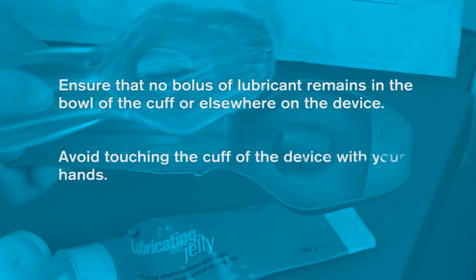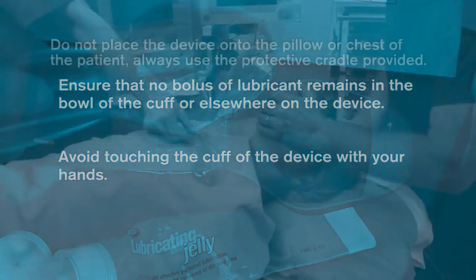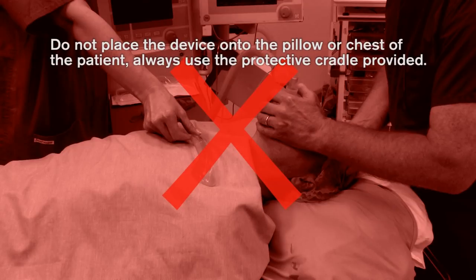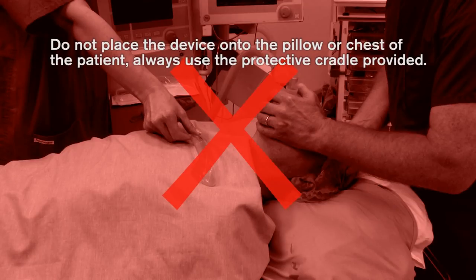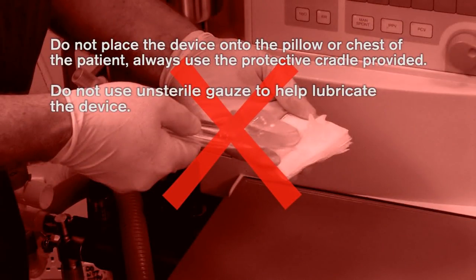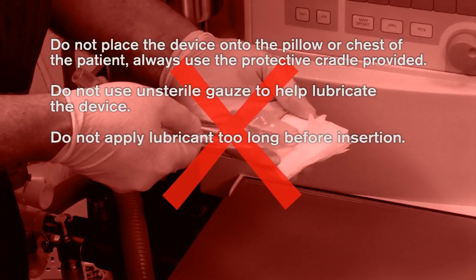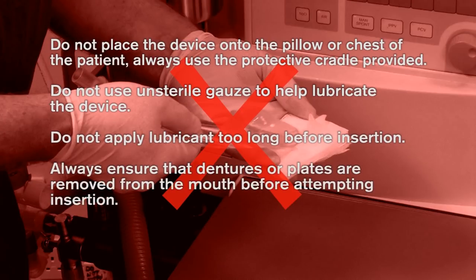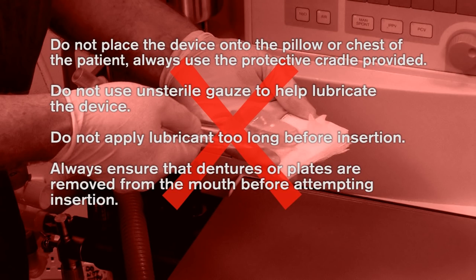Avoid touching the cuff of the device with your hands. Do not place the device onto the pillow or chest of the patient and always use the protective cradle provided. Do not use unsterile gauze to help lubricate the device. Do not apply lubricant too long before insertion and always ensure dentures or plates are removed from the mouth before attempting insertion.